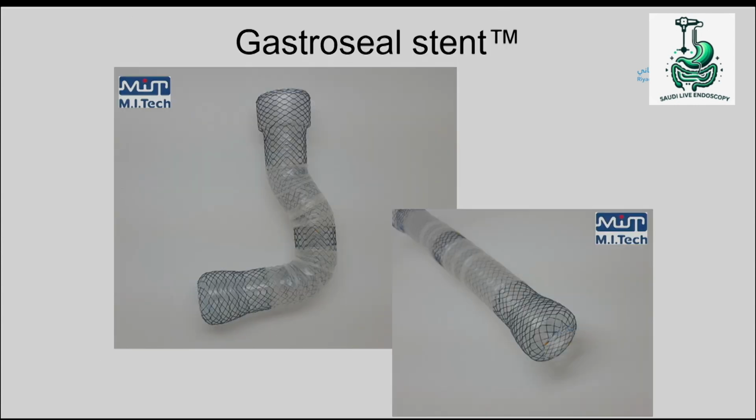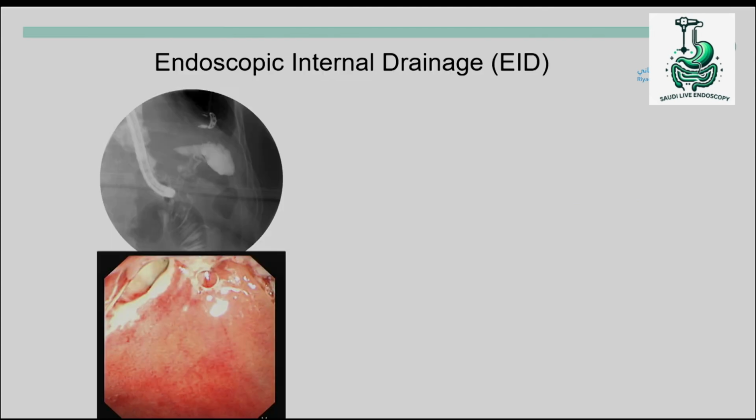We did work on modifying a stent. This is not the stent that we're working with nowadays. It has much less sharp edges and it's much more flexible. We hope that they do give better results.